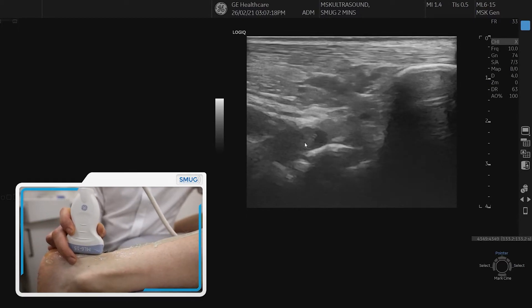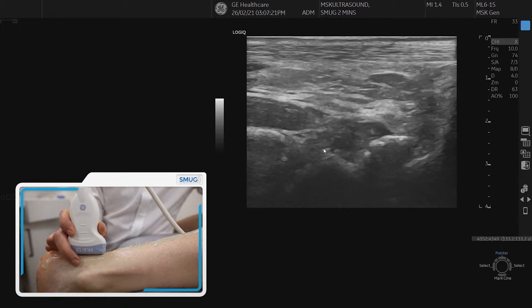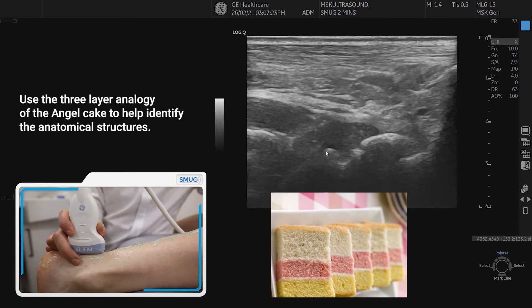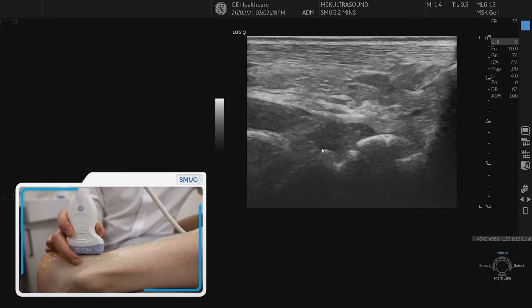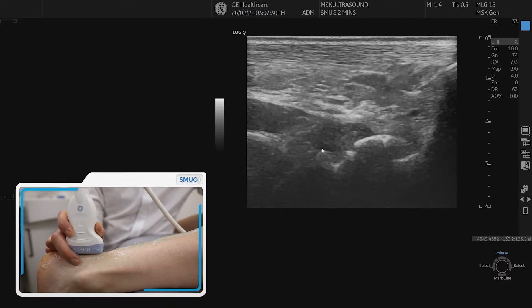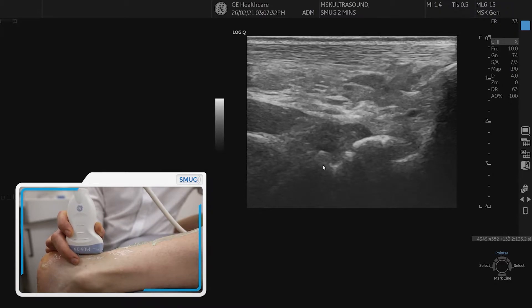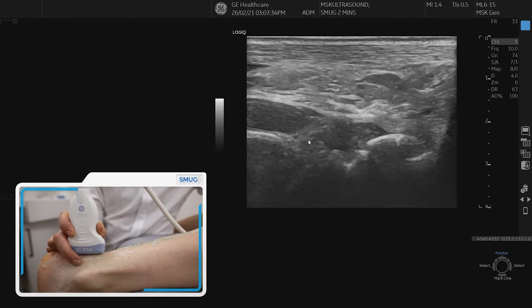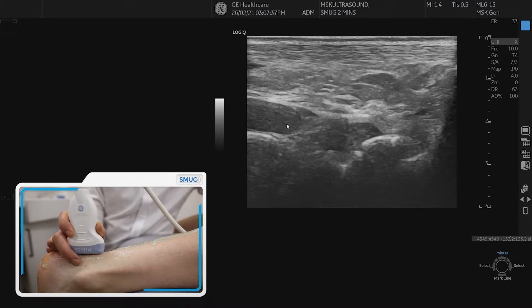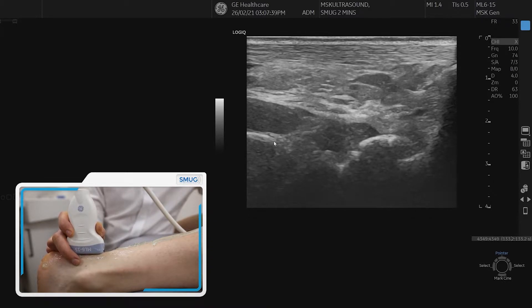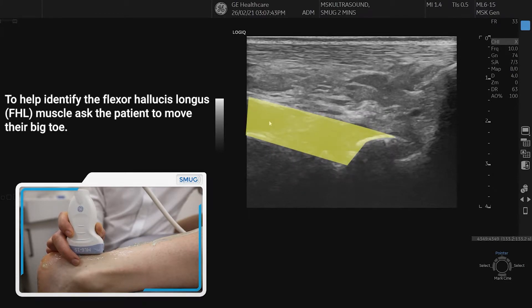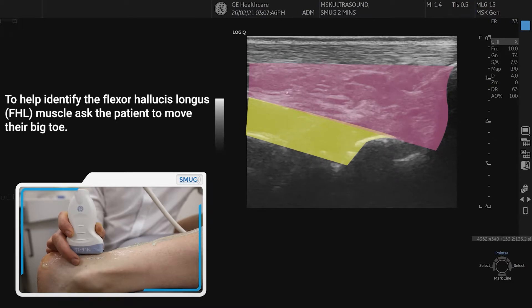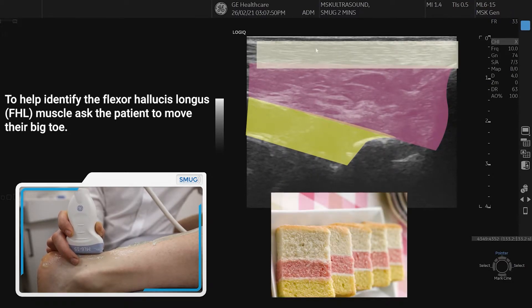Moving further up, we identify the angel cake layers, which vary anatomically as we move up the calf complex. The most distal angel cake layer shows three layers: the FHL, which is the deepest and a very large muscle — moving the big toe confirms the muscle belly moving — above that the hyperechoic Kager's fat pad, and most superficially the Achilles tendon.